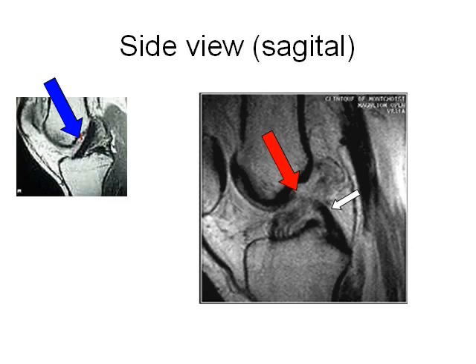The side or sagittal view is the best MRI for viewing a normal anterior cruciate ligament. As shown in blue, the red arrow shows a torn or missing ACL. The white arrow shows a normal, dark, posterior cruciate ligament traveling up and behind the torn ACL.